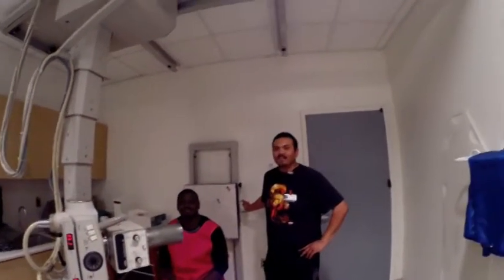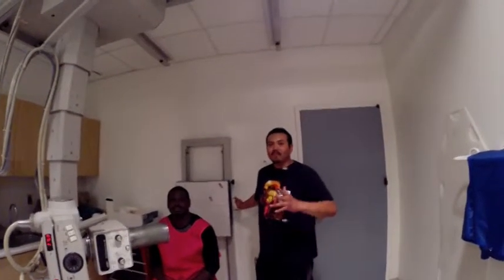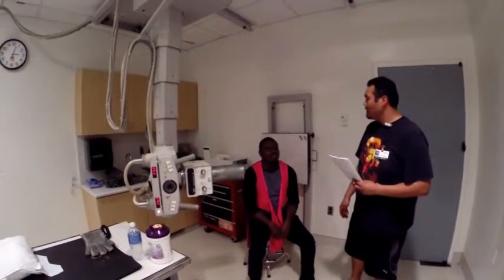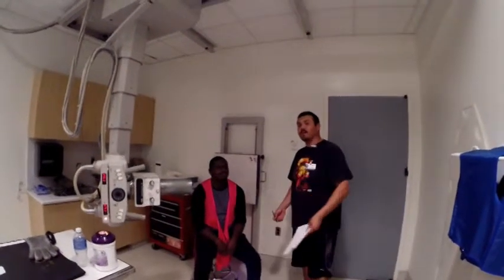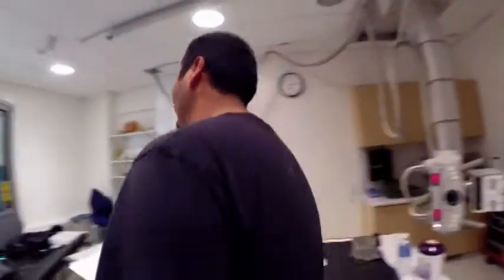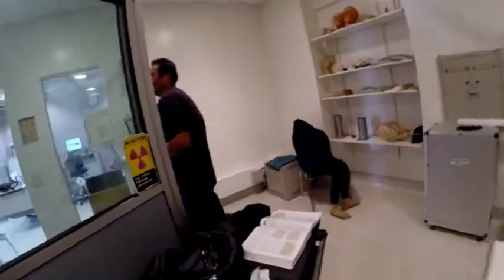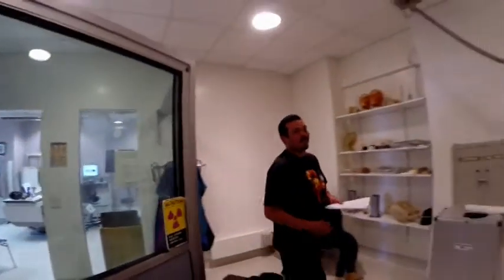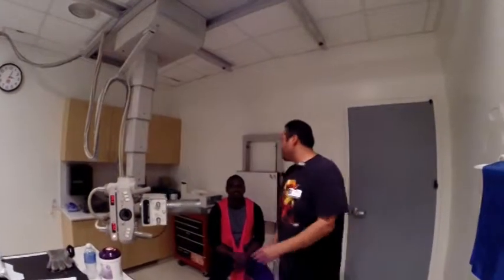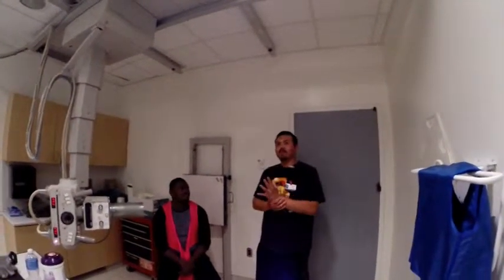That's going to be it for the sinuses. We'll be back in a few minutes to do another series on Mr. Hutchinson. Now we're going to turn on the machine — we have an order for Mr. Hutchinson and this time we're going to do a series on his mandible. He unfortunately got into a fight and we're going to do a total of four shots on his mandible.